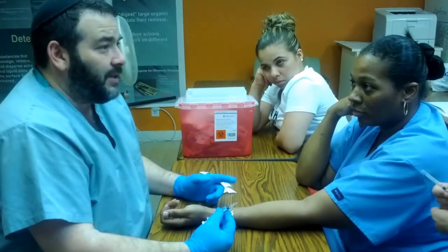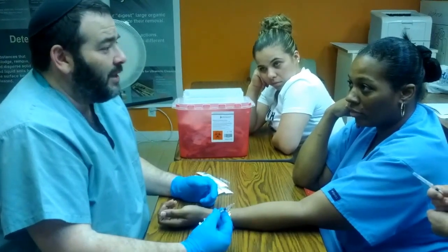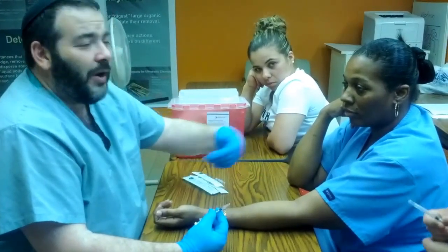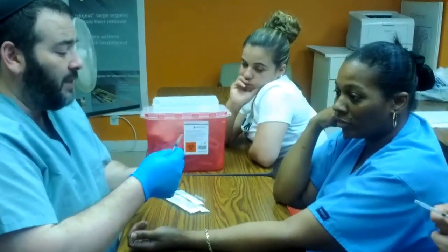Okay, alcohol has to dry by itself. The longer alcohol stays wet, the more disinfected the site of injection is. Don't try to wipe it with a gauze. Don't try to blow it with your hand like this. These are all mistakes that people make. Okay, make sure the alcohol dries by itself.